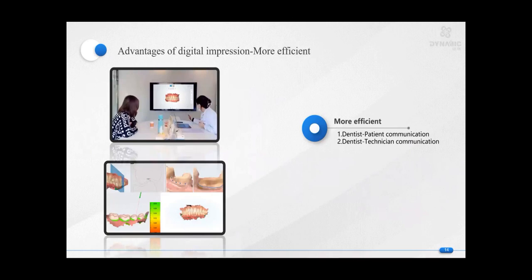With the intraoral scanner, everything becomes very simple. We can see from these 2 images, we just need to communicate with our patients directly through the screen display on the computers.